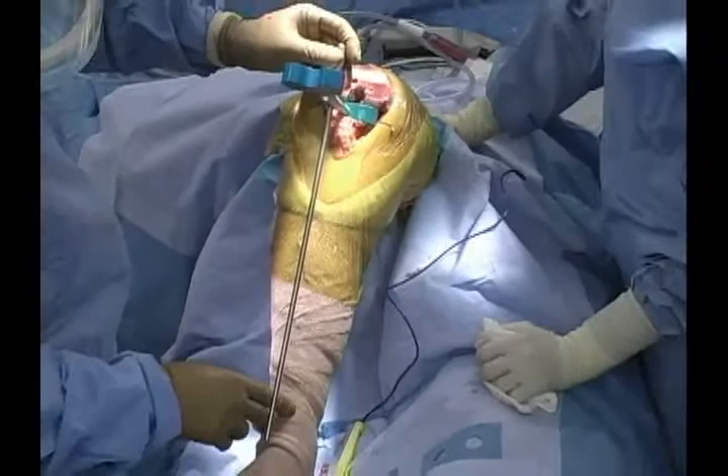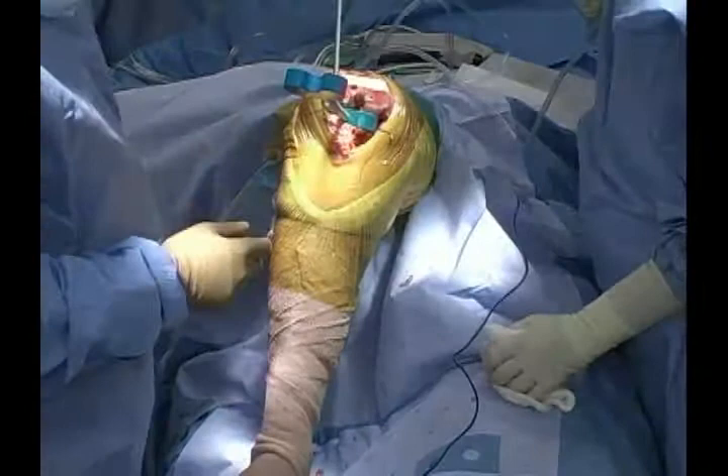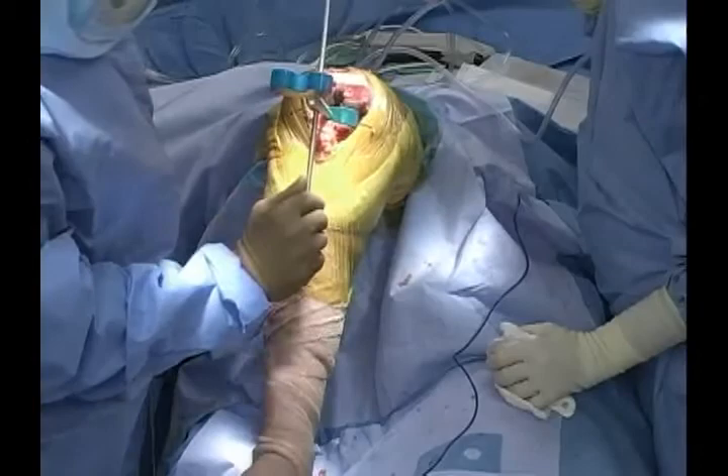I believe that my flexion space is fairly well-balanced. You can use this rod to help assess that by twisting it, and that gives you a nice estimate. I believe we're very well-balanced in this particular case.